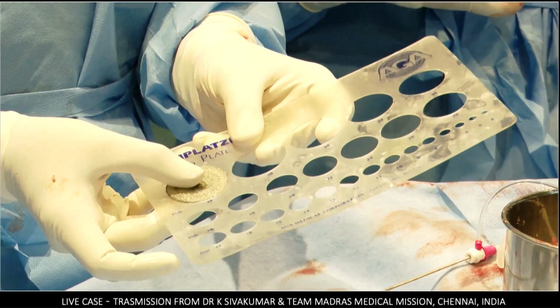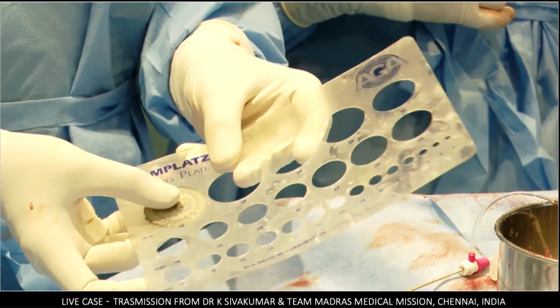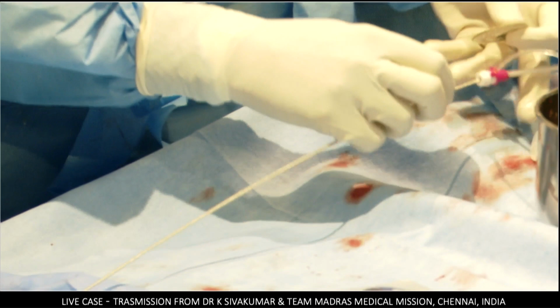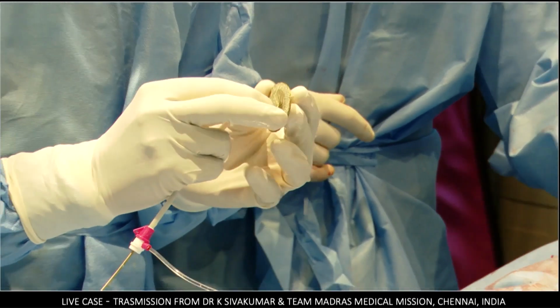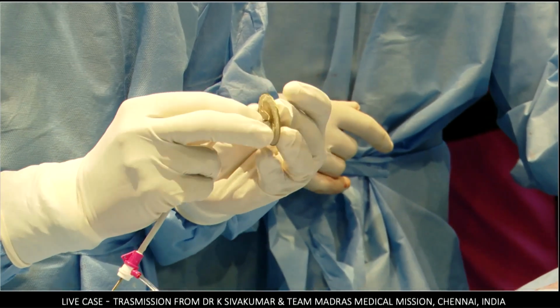The one that I'm planning to use is 40 millimeter. So okay, Warrican's got a question for you. Yeah, thanks, Shaq. Shiva, hi, Warrican. Good morning. Hi, Shiva. Good morning, and good morning to your team.